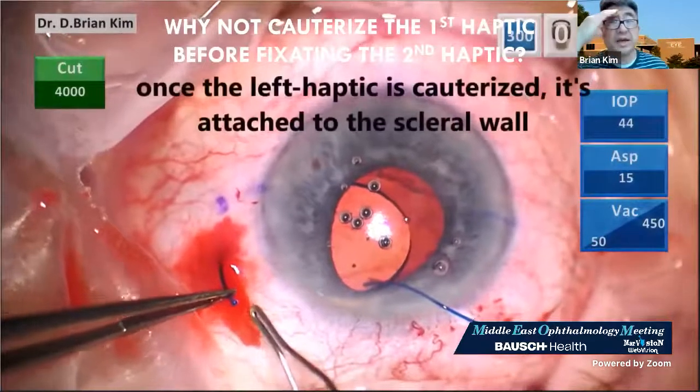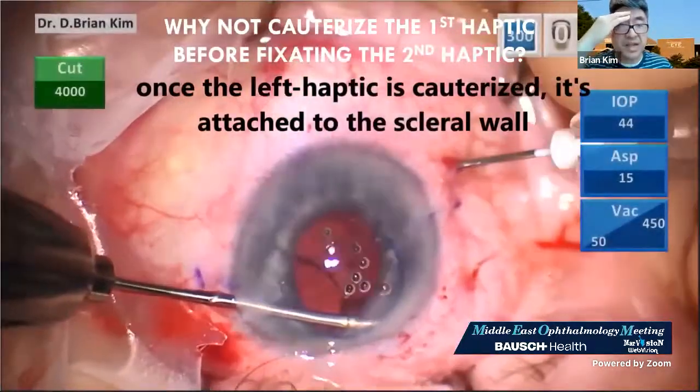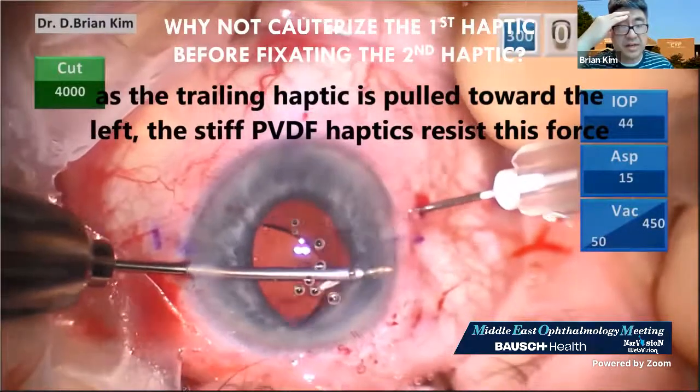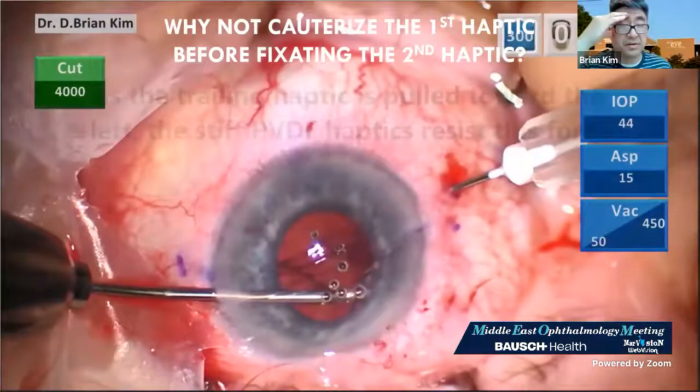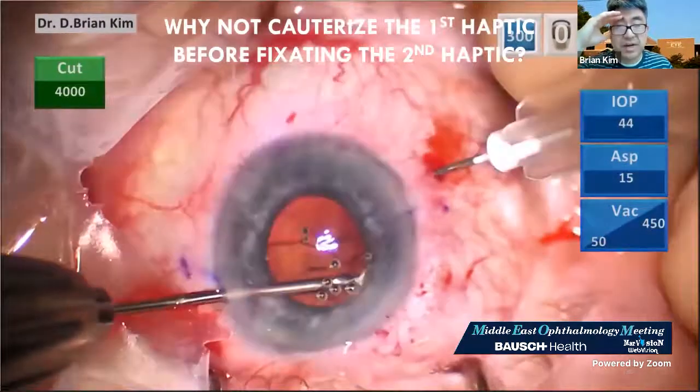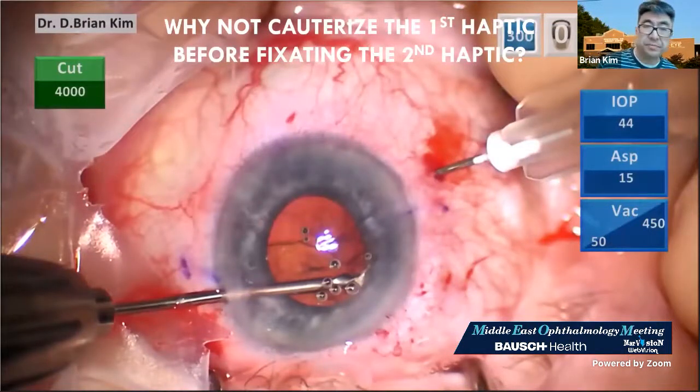So you can see that here. This is, again, my mistake. This is when I was first experimenting with the technique. And as I've discovered, like others I'm sure have, this is the fastest way to either break the haptic or just create a lot of frustration.